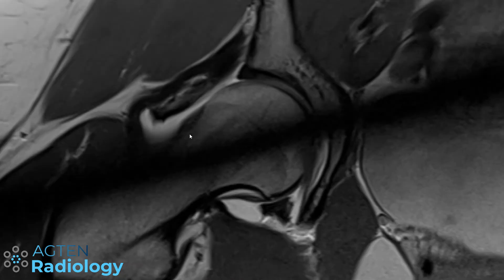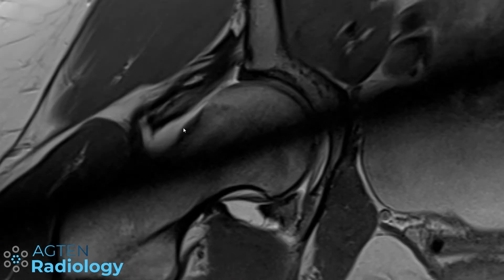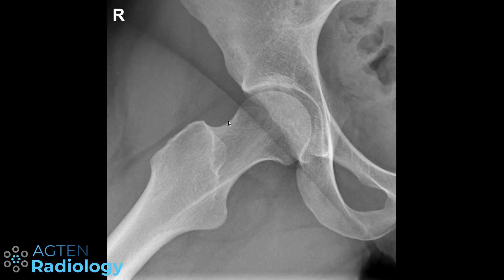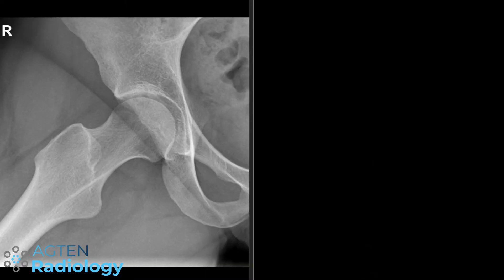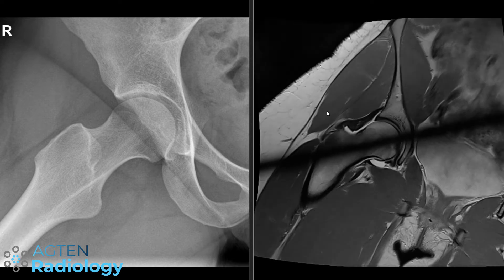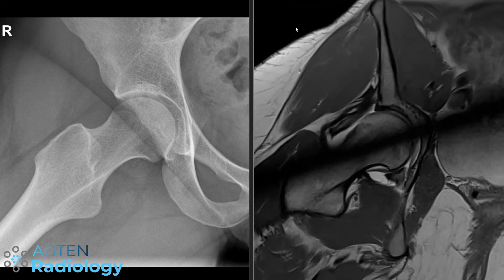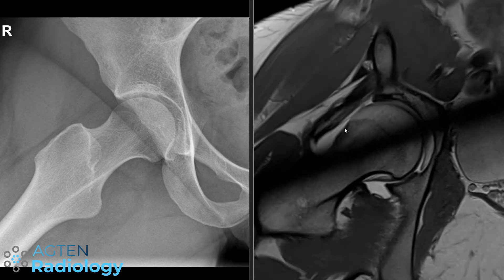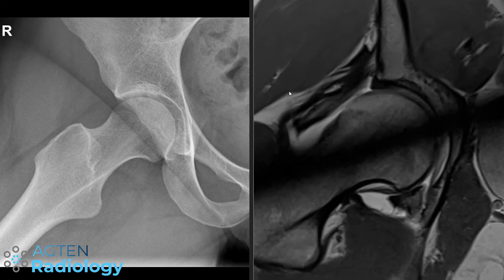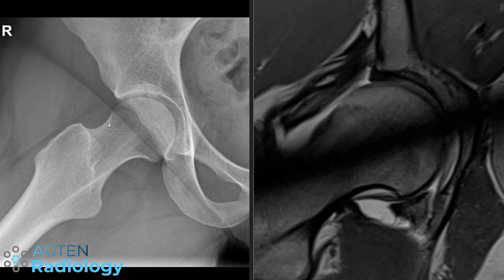So here's a quick repetition of how a soft tissue CAM lesion looks, with this periosteal hypertrophy here which is not bone. We can easily see that it's not bone when we compare at the same location on the X-ray. Let me put these next to each other because I think this is really important to understand. So we go to the same location and we can see the radiograph is quite smooth.